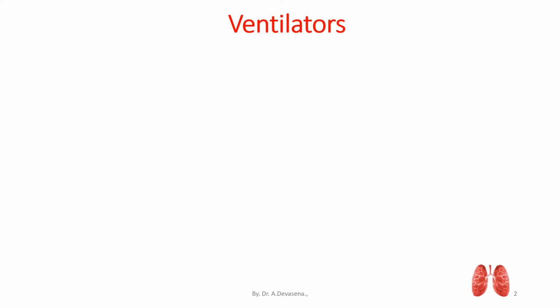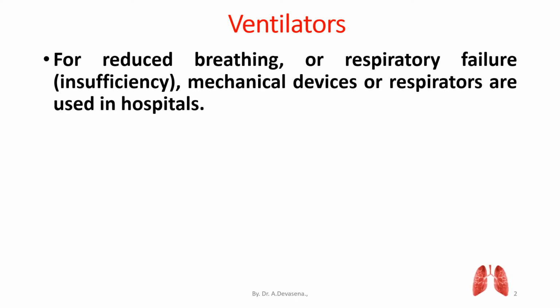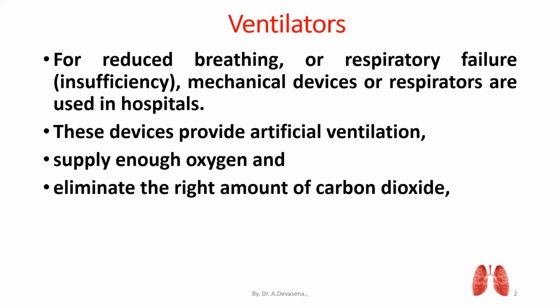Ventilator. For reduced breathing or respiratory failure, that is insufficiency, mechanical devices or respirators are used in hospitals. These devices provide artificial ventilation, supply enough oxygen, and eliminate the right amount of carbon dioxide.